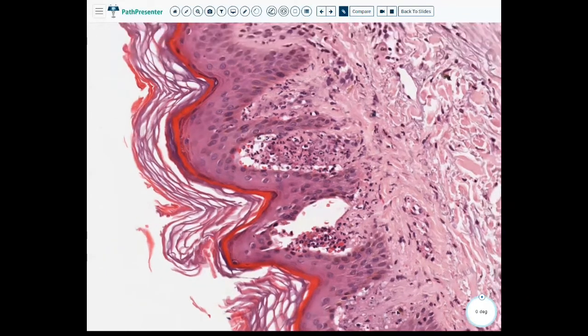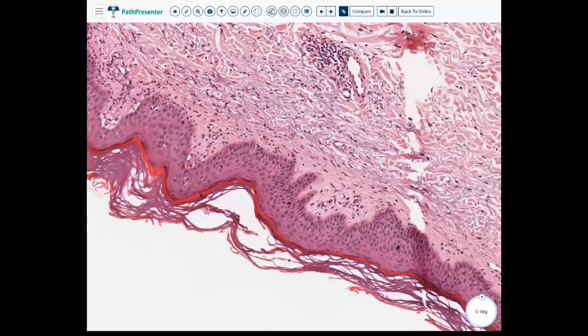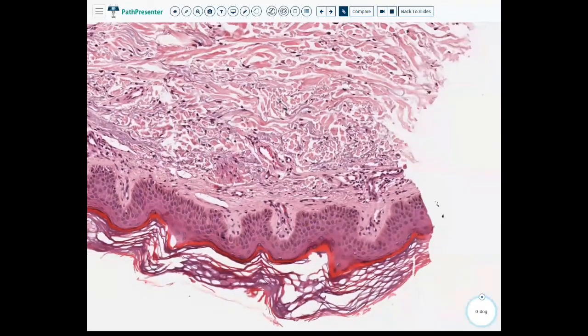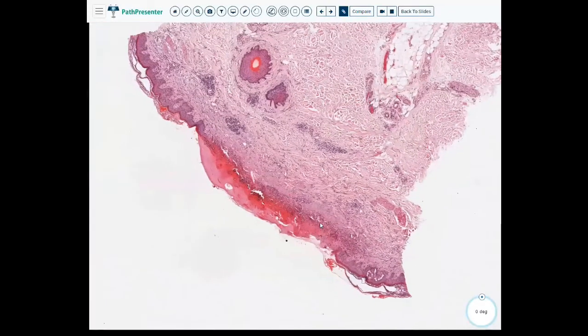More of it here. But this looks a little different from all our bullous lesions. And so what this is, if we go back here, this is dermatitis herpetiformis, and you can imagine because these lesions are so itchy that patients are prone to scratching at them. So likely what happened here is that this was really itchy and they scratched at it and they unroofed this area. So we had this excoriation here that gave us this ulcerated area. So this is dermatitis herpetiformis.